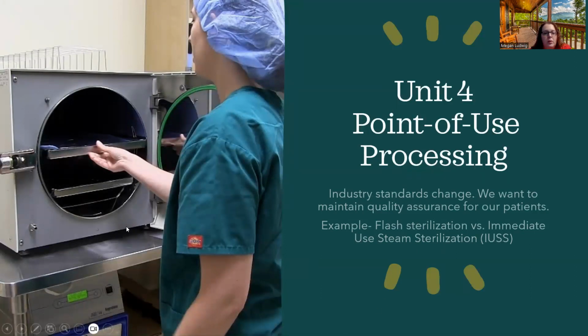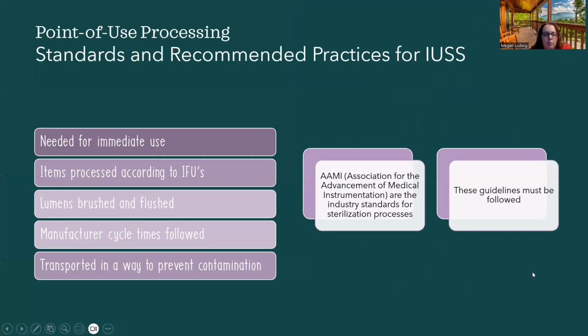So they were using this flash sterilizer when they really shouldn't have been. So they got away from saying that to try to guide them towards just for immediate use if you need it right away.